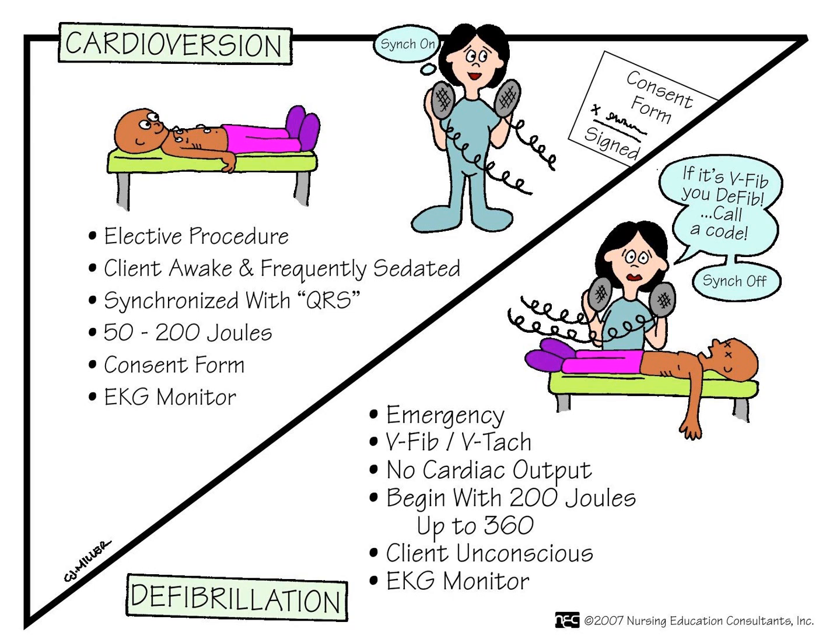Now this slide makes the distinction between two procedures that we have going on in the hospital, especially for our hemodynamically compromised patients as a result of a dysrhythmia. So let's first talk about cardioversion. Cardioversion, sometimes also referred to as synchronized cardioversion, and you see that this nurse here has her paddles, so to speak, and she has the machine set to the sync mode.